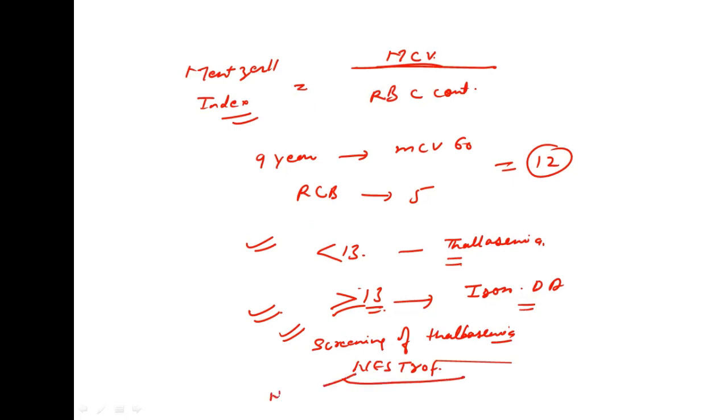This is naked eye, single tube, RBC, osmotic fragility.